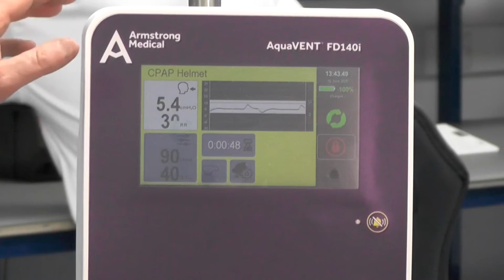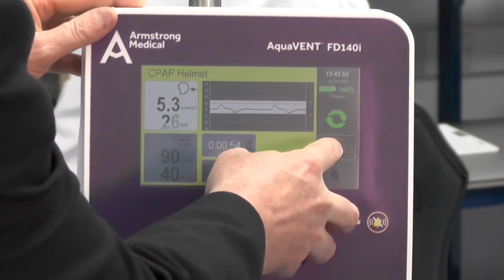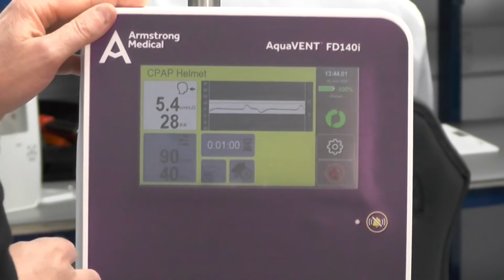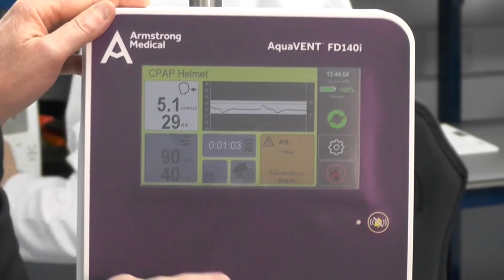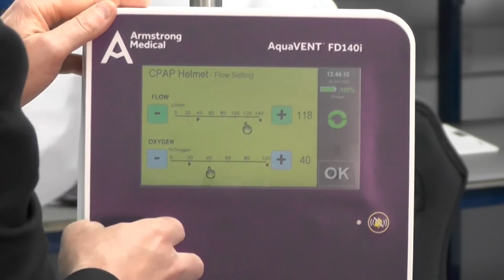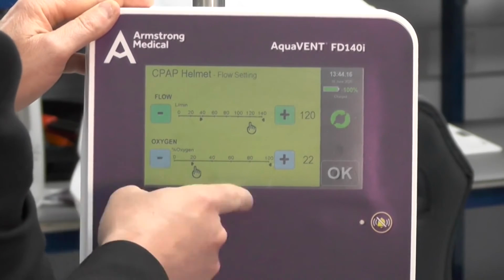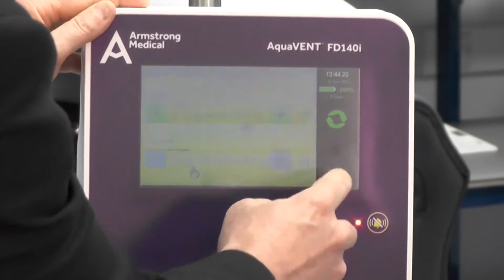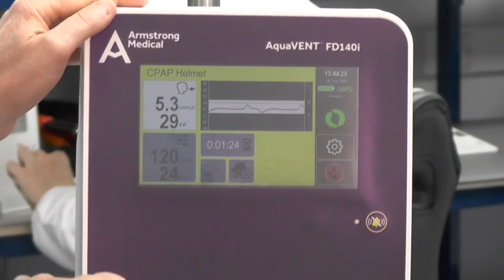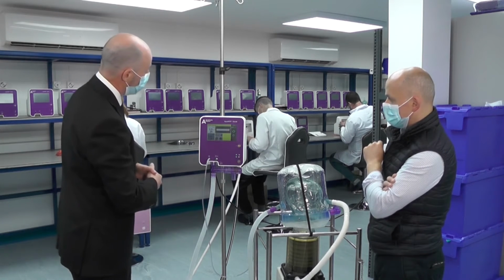If we want to at any point change the settings, such as the flow rate, we first always have to unlock the screen, so press the locked red icon once. Do you want to unlock the screen? You do, so you press the green tick. And then if you want to change the flow rate from 90, you just press the icon where the flow is and perhaps change it to 120. Change the oxygen down from 40 to, say, 24. Press OK. It asks you, do you want to accept these changes? And you hit yes, and you can hear the system immediately start to change.